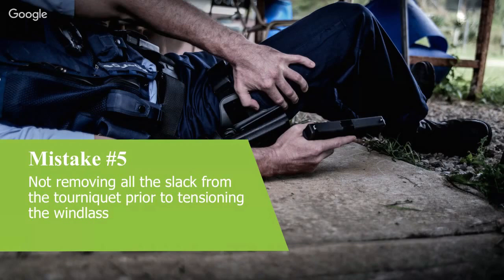Demetrius, putting tourniquets on heavy venous bleeding, is it ineffective? No, it's not ineffective. And certainly there's a lot of tourniquets that end up on heavy venous bleeds in the tactical environment. You're looking at a wound, it's hosing blood, you think, oh, maybe I should, so you do. Then they can revise that at the next level of care, or if you've got a combat medic, or when you get in an environment where you can look at it closer and work out, now hang on a sec, this is venous, it's dark blood, it's oozing out, it's not pulsatile. I'm going to convert that to a pressure dressing, hemostatic dressing if required.